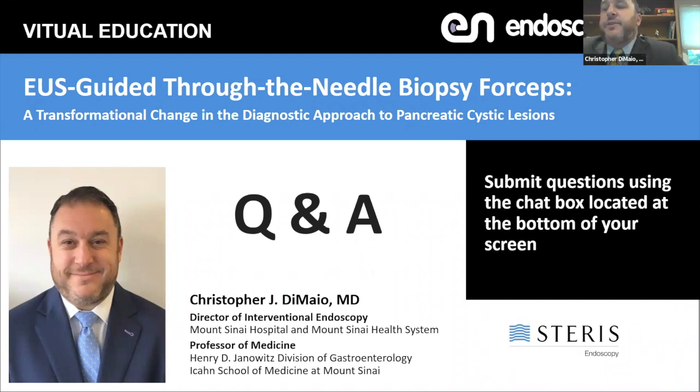If they're talking about the use of a core biopsy to get a piece of the cyst wall, there are reports of this. There is published literature in case series. Personally, I'm a little uncomfortable with this because whenever we do a cyst FNA, our goal should be to not puncture the cyst multiple times. There's a risk of leakage of cyst contents, a risk of bleeding, and notoriously pancreatitis. So it doesn't make inherent sense to me to purposefully drive a fork-tipped or core biopsy needle through the wall to get tissue. Yes, there is success in getting tissue, but I am not a proponent of that technique.